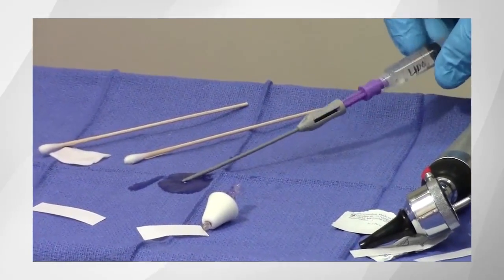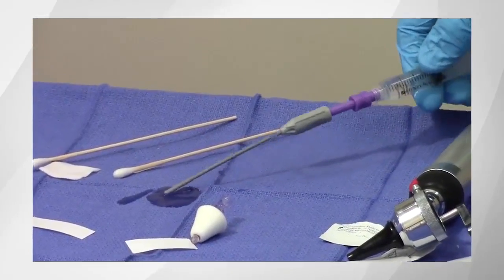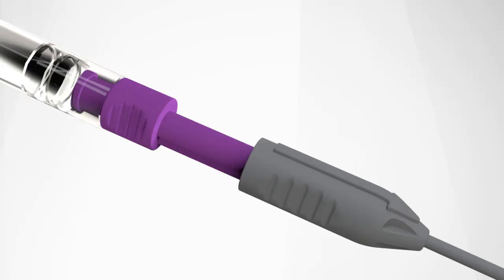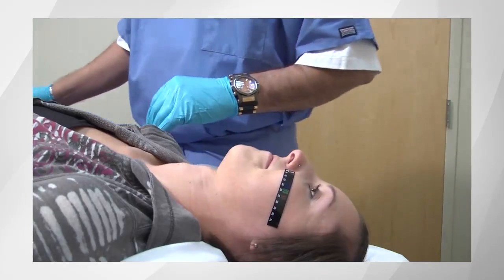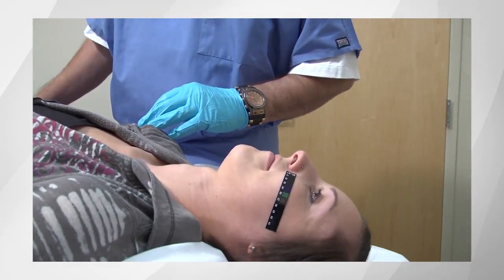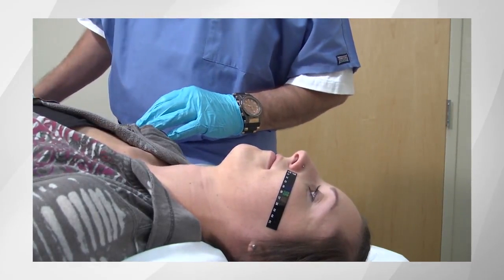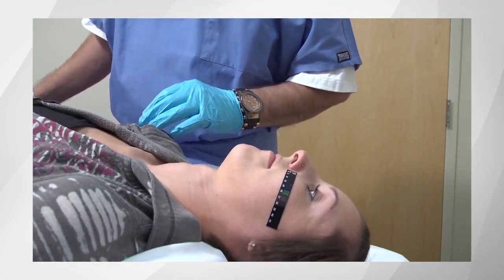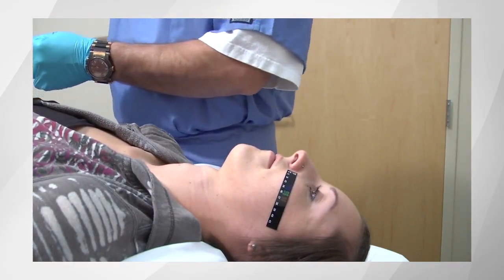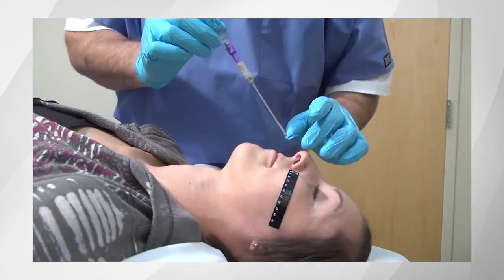In preparation for inserting the SphenoCath connected to the lidocaine syringe, lubricate the distal 1/3 of the device. Make sure the inner catheter is in the retracted position and the direction indicator on the hub is facing towards the ceiling. Prior to actual insertion, remind the patient that they may experience a brief, mild twinge of discomfort when the catheter comes in contact with any part of the nasal sinus mucosa. This is a normal response and should not cause concern.